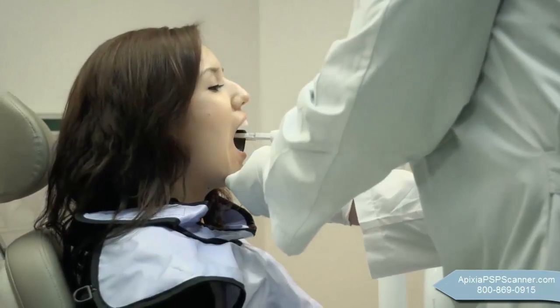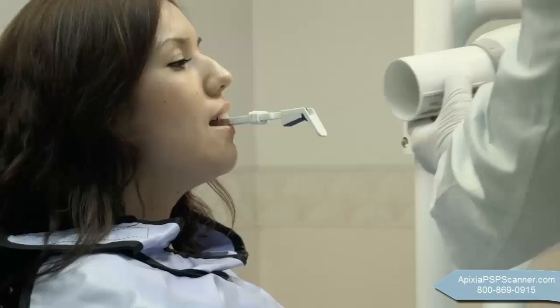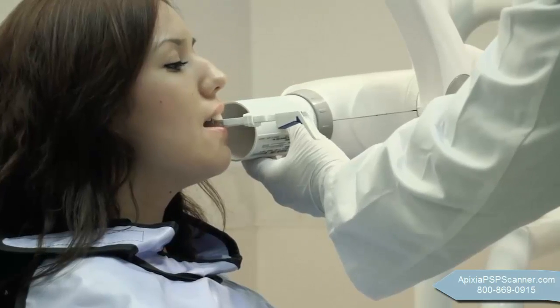After a quick scan of exposed plates, high-resolution images are ready to be stored, emailed, and printed at the touch of a button.